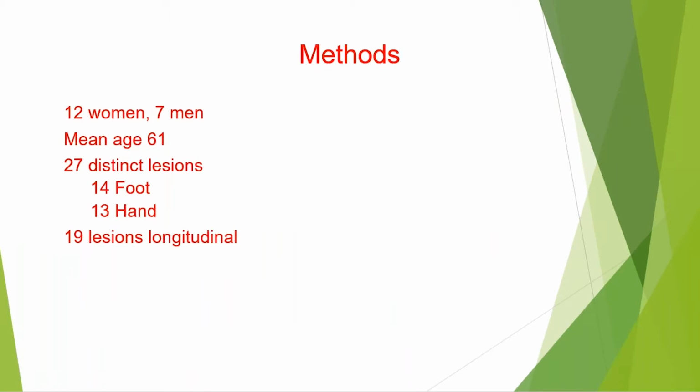The most recent study involved 19 patients and looked at 27 different lesions, although unfortunately we did not have T2 mapping for all the patients. And I will specify where the T2 mapping was done versus just the evaluation of the T2 relaxation times of pre and post irradiated patients.